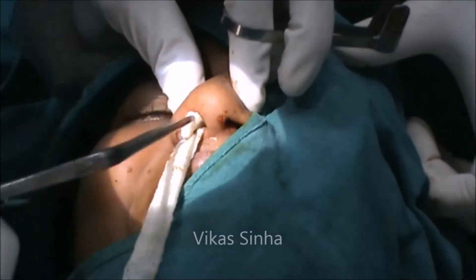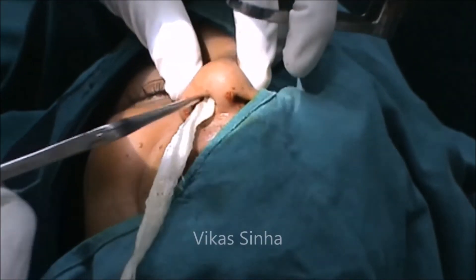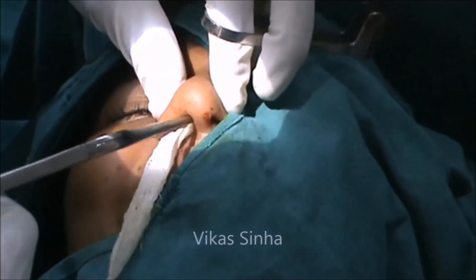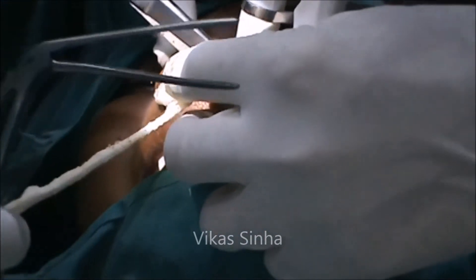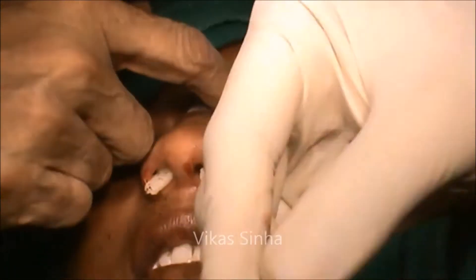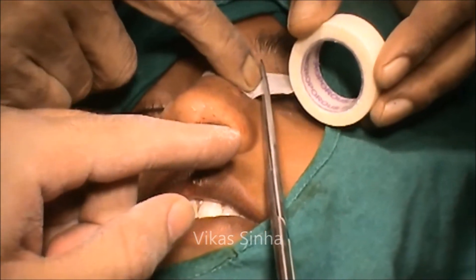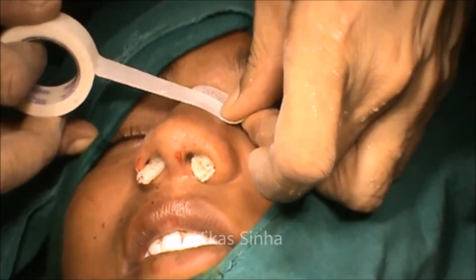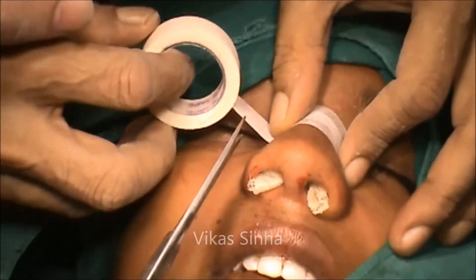The nose is lightly packed, which is removed after 24 hours. The micropore is applied to prevent the displacement of the reduced nasal bone. It is to be applied one-third overlapping with the other, one-third, one-third.